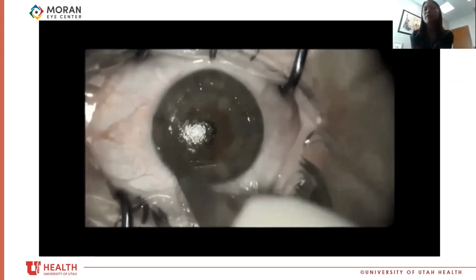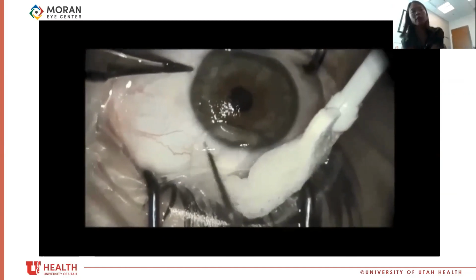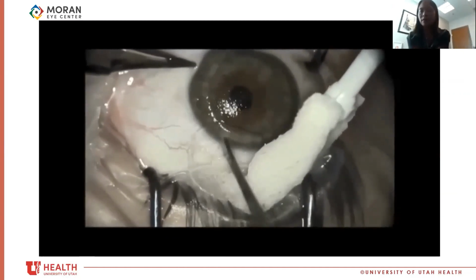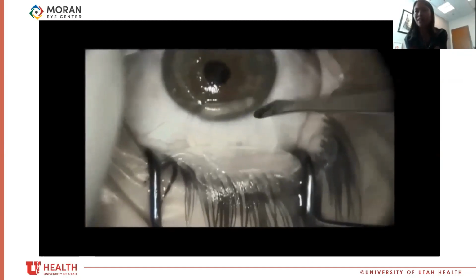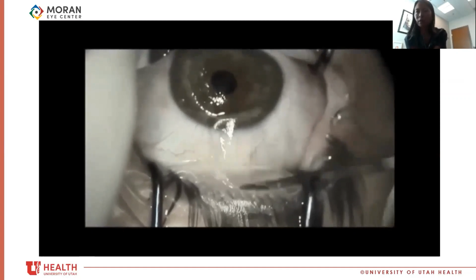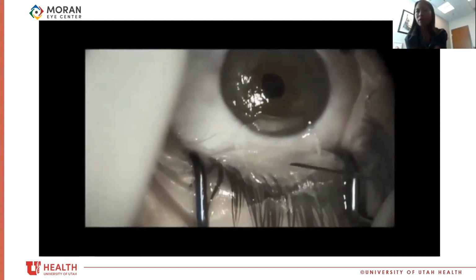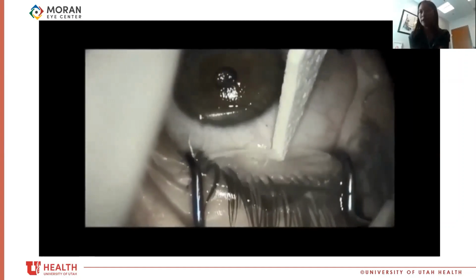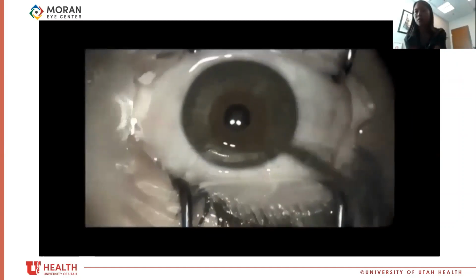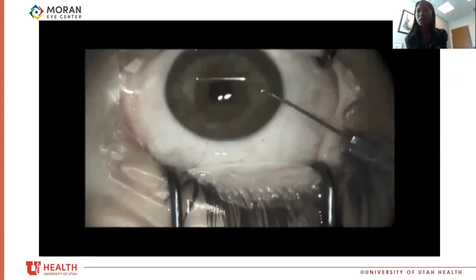It's not really apparent on this video, but this patient was complaining the whole time. She was feeling pain somehow with all the topical anesthetic and IV sedation. So it was really hard to achieve all this. So I'm showing you the good parts of the surgery when she's not moving around. I actually wanted to scrape more, but she really couldn't tolerate her eyes moving around. So I'm scraping as best I can. I do a big rinse, lots of rinsing.